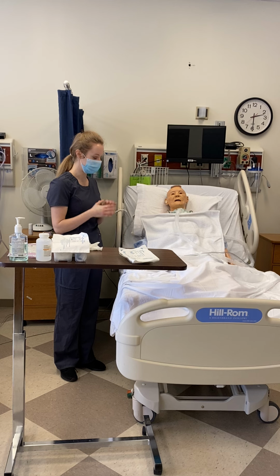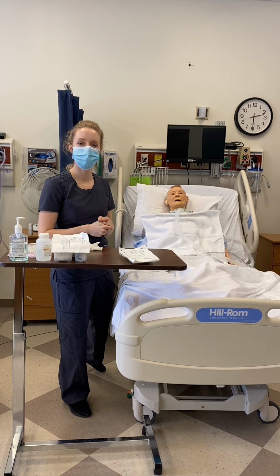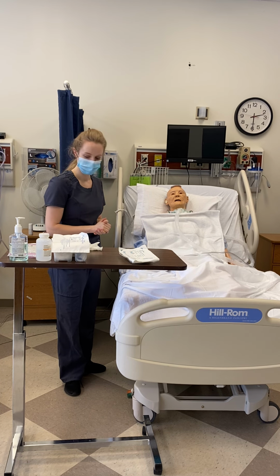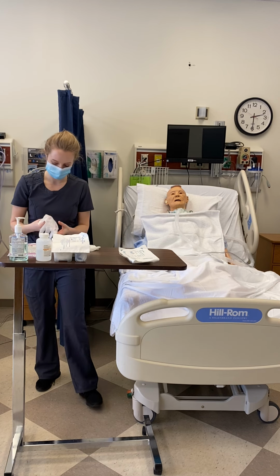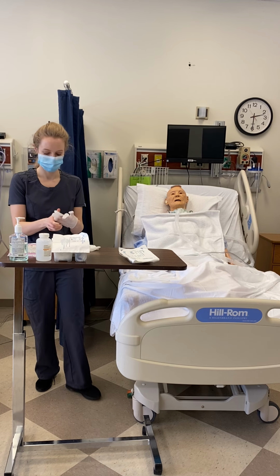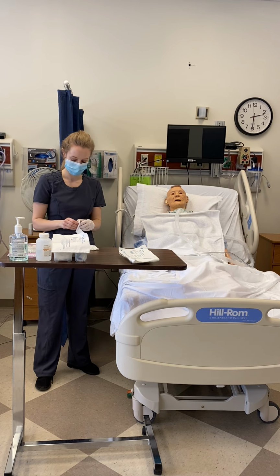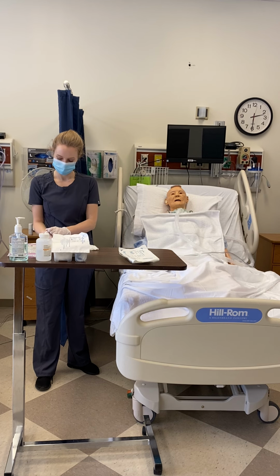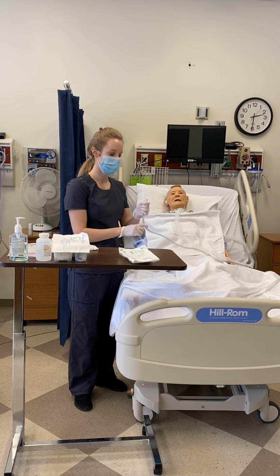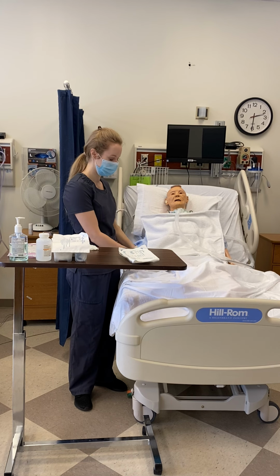Ensuring that everything here is ready to go, I will turn my suction on to 80 to 100 or per hospital policy. I will don clean gloves, and what I want to do is check that my suctioning is working by occluding the suctioning and ensuring that everything is working properly, and it is.